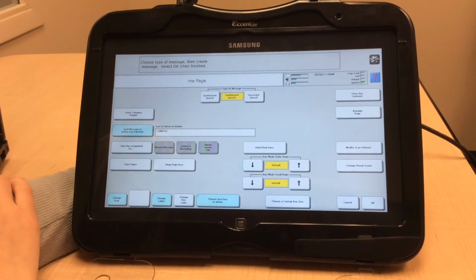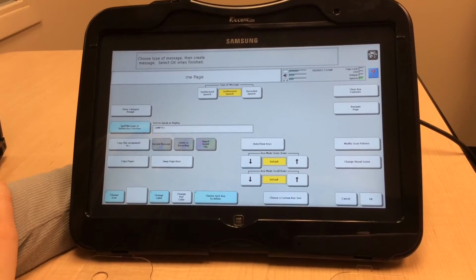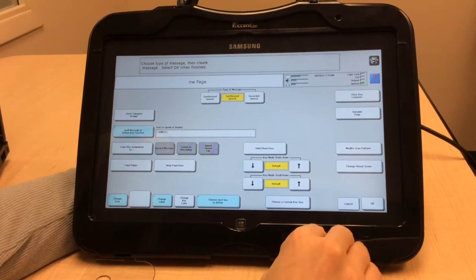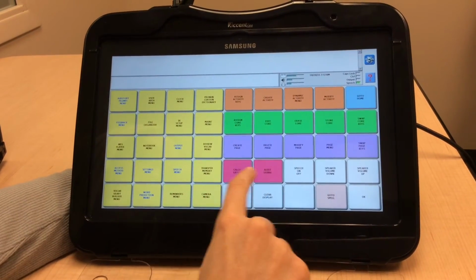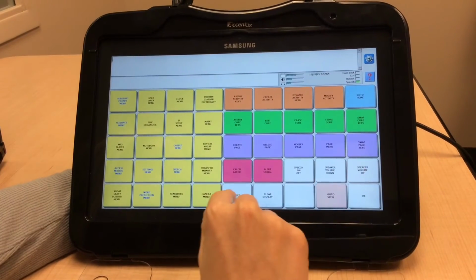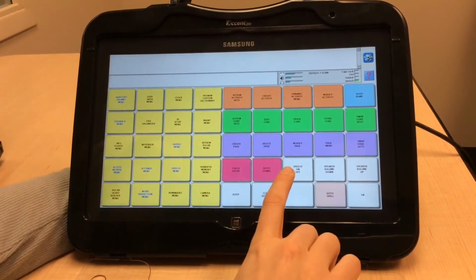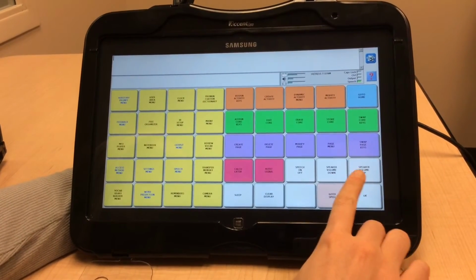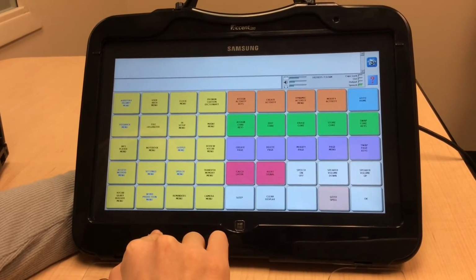If we click on one of them, that allows us to personalize that exact key to that certain page. We'll press cancel, and we're back to our main page. These hot pink buttons, we have calculator and alert signal. The white buttons are pertaining more to the functional devices of the device. So we have speech, you can turn it on or off, volume up or down, and then you can clear display or sleep.